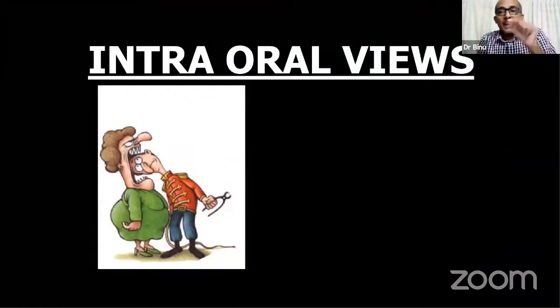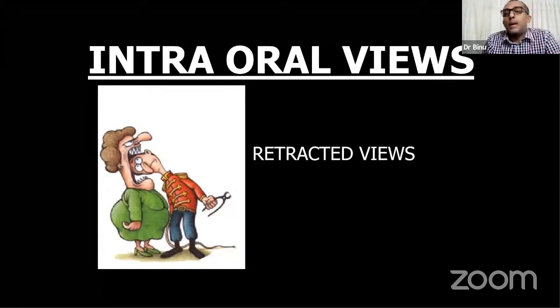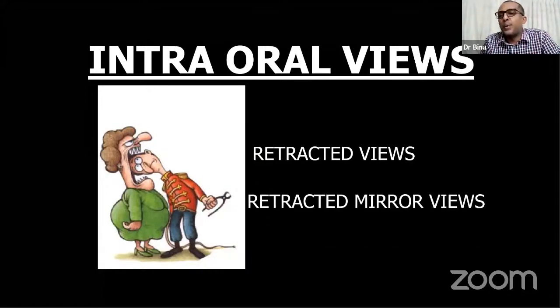Intraoral view, I'm going a little inside, tougher now. Yeah, frontal was the easiest. Profile a little tougher because of the shadow. Now intraoral. When it comes to intraoral, there's something called retracted view and retracted mirror view.